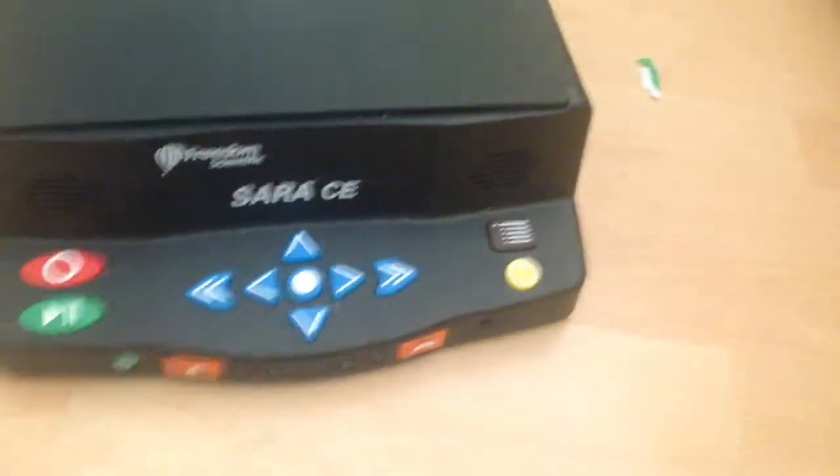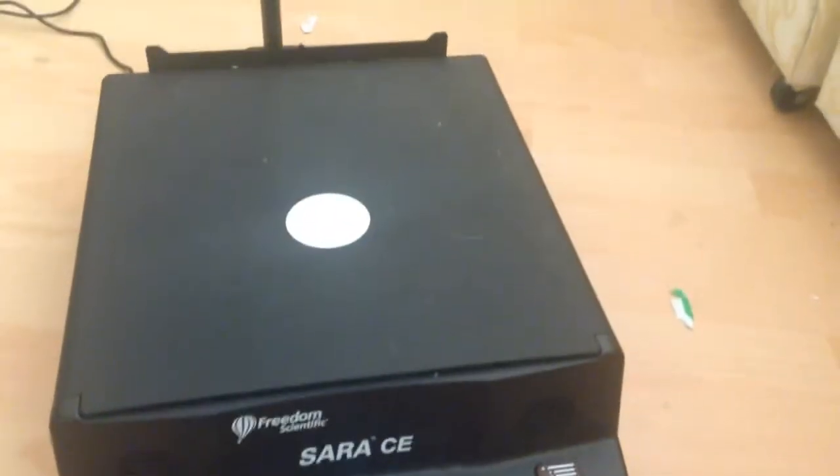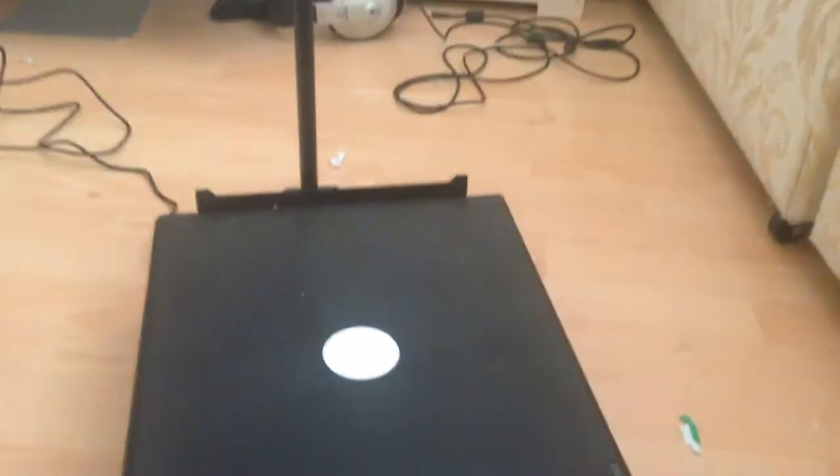For those who can't see, I'm pointing at the front panel and it says Freedom Scientific SARA. SARA CE is a reading machine for the blind, rather like my old Reading Edge that I used to have, which you have seen on a video before.